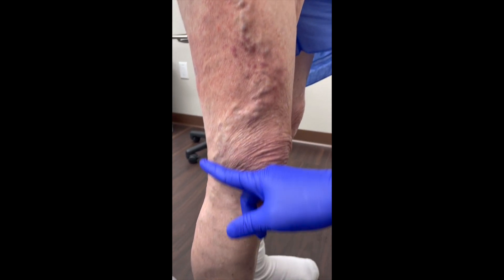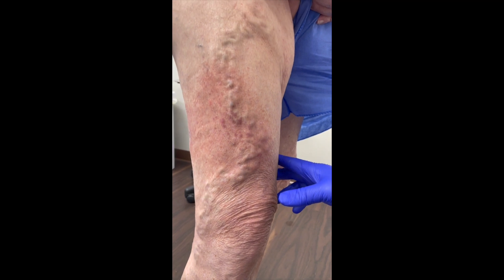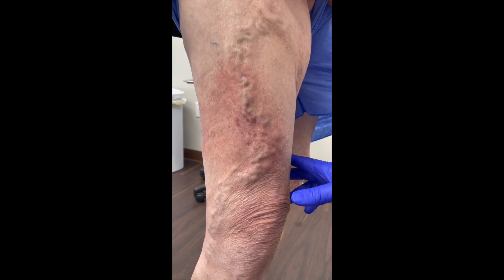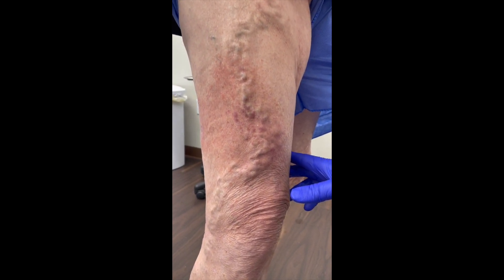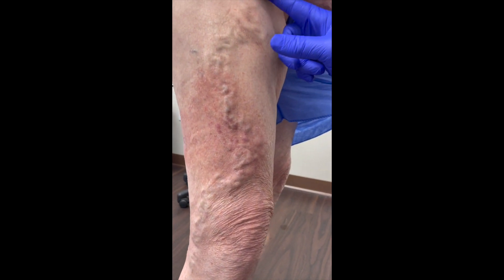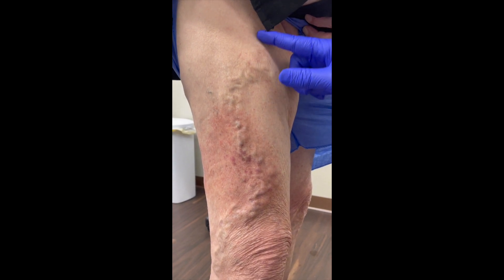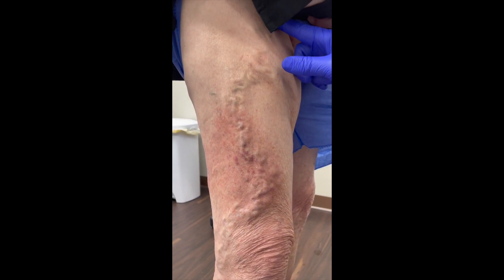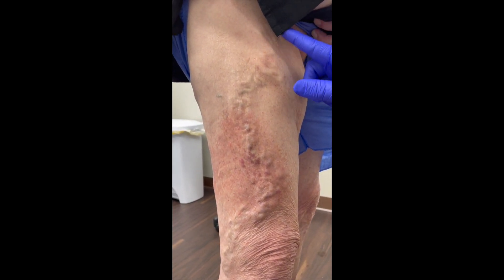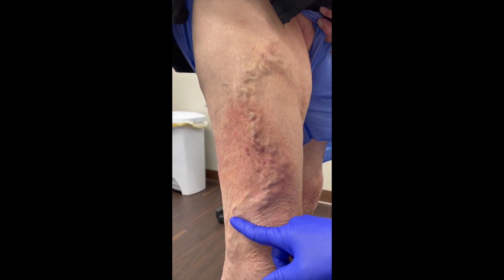Not down here — a lot of times they're down lower, but it's just an unusual pattern. So when we do him, we'll inject up here to close off the origin, then do phlebectomies down to here.